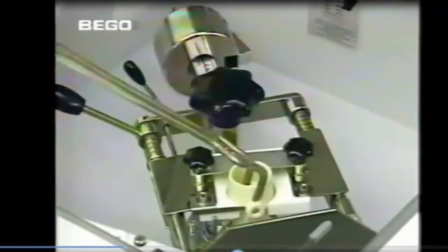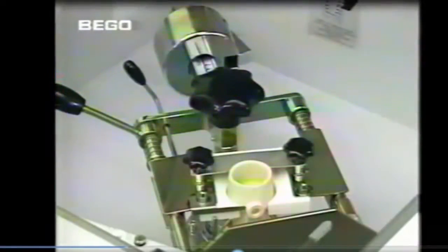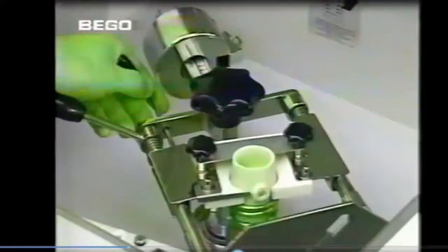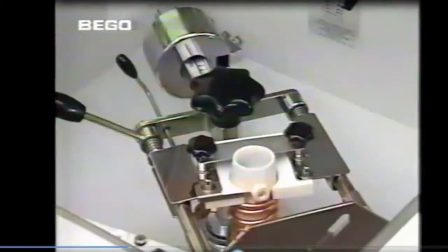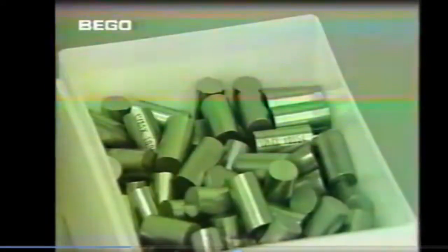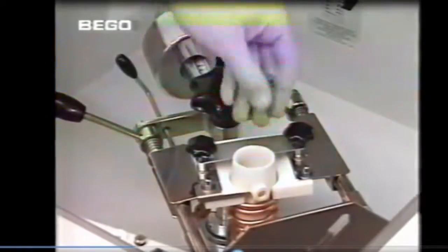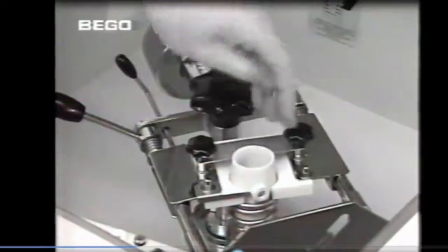A variety of casting techniques are used for melting and casting cobalt chrome alloys. This video shows the melting of cobalt chrome alloys with high-frequency induction currents and an open flame, and casting using the centrifugal and vacuum pressure techniques. The crucible preheated with the muffles has been placed in the centrifuge for casting in the Fornax 35K. The ingots lie close together for even preheating.